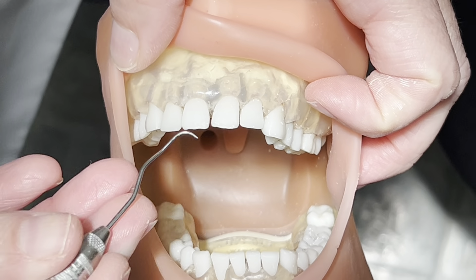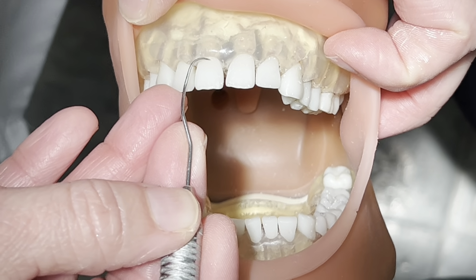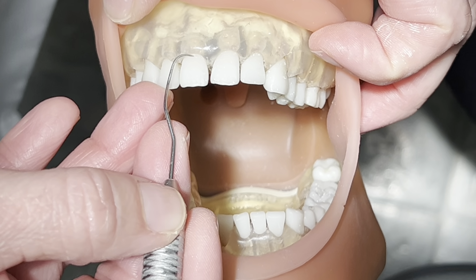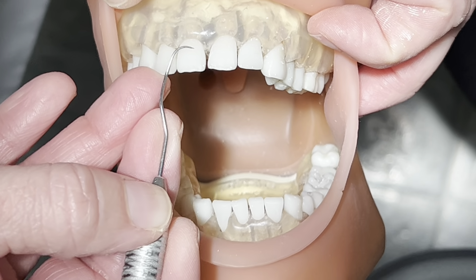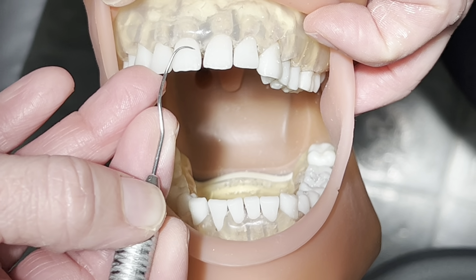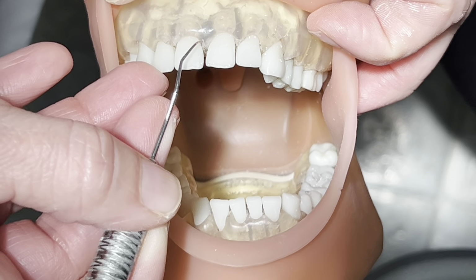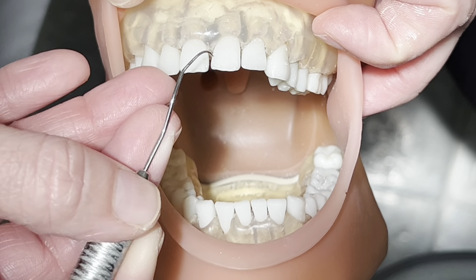you want an assessment stroke. So remember the things we learned in this lab activity with an assessment stroke. We want very light pressure in the grasp. So we don't want to see the fingers blanch, and very light pressure with the stroke. You should hear little to no sound with that stroke.